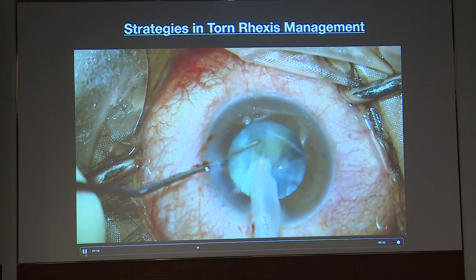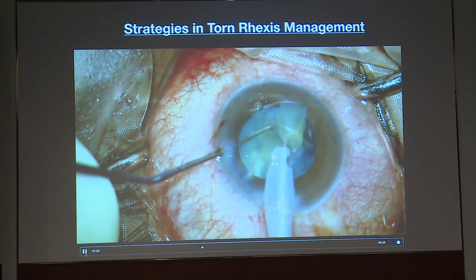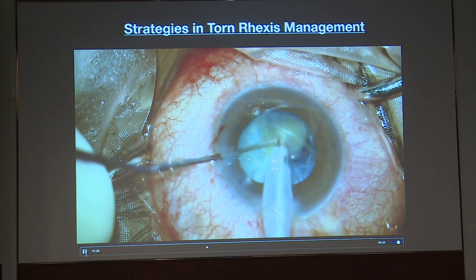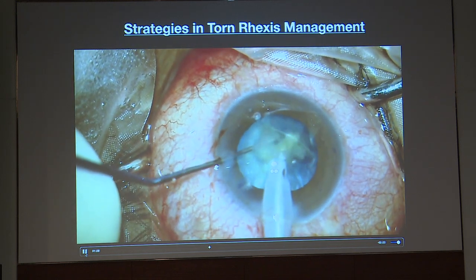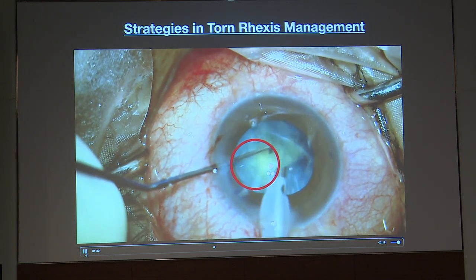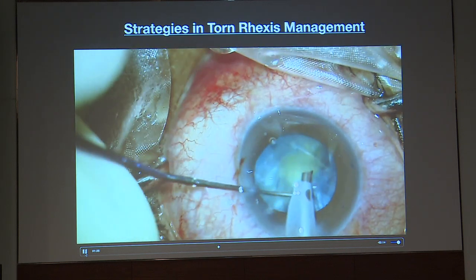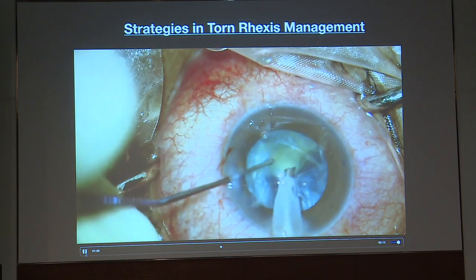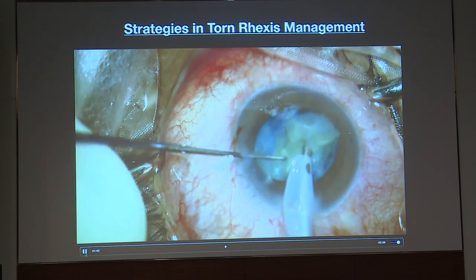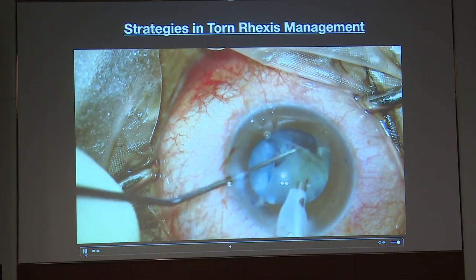There were minimal separational forces applied again. I also avoided sudden collapse or deepening of the chamber. My phaco parameters were on the lower side. The flap was still everted and fluttering. The initiation of rotational forces was minimal, and was done keeping in mind that the rotational force did not put stress on the extended flap.